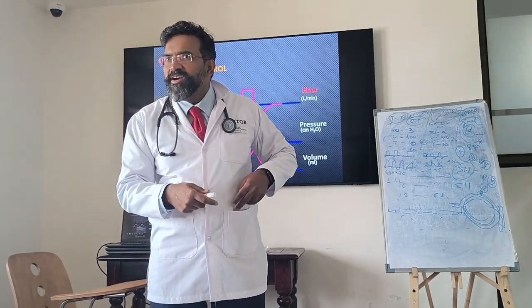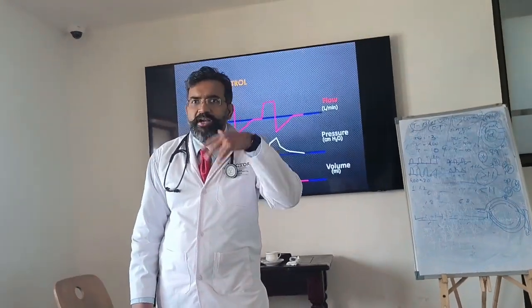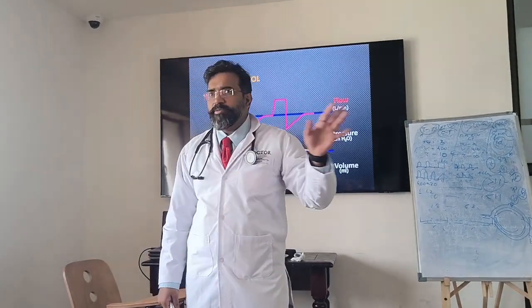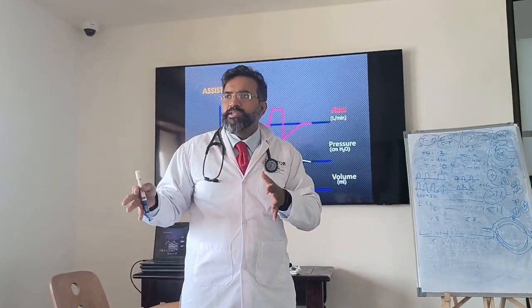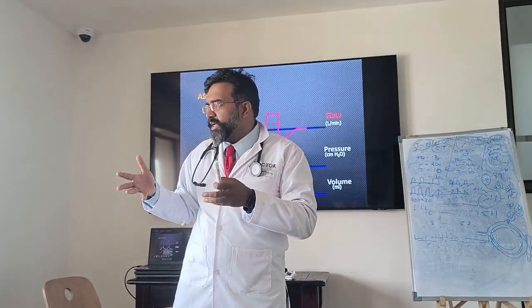What you have to do here? Treat the problem. And if the problem is not getting treated, paralyze the patient. Otherwise इसकी problems अलग है. इसकी problems for long term is what? Volume इतना अगर तुम 12 लीटर अंदर दोगे, हर मिनट में 12 लीटर दोगे तो पूरा lungs inflate हो जाएगा.